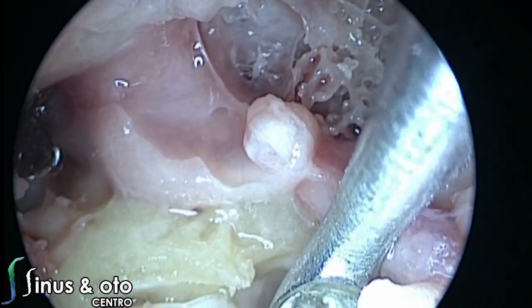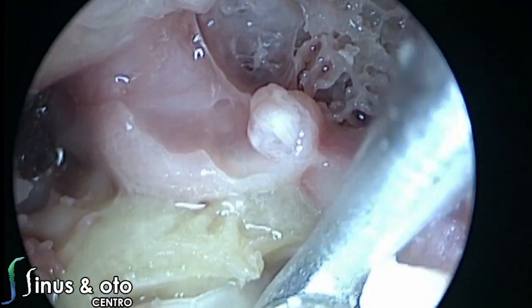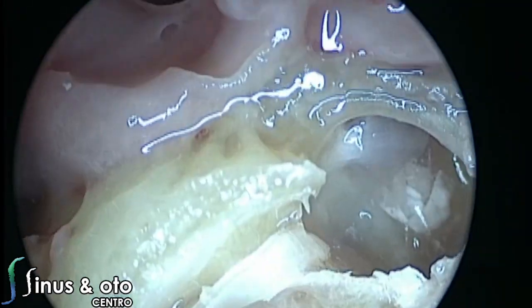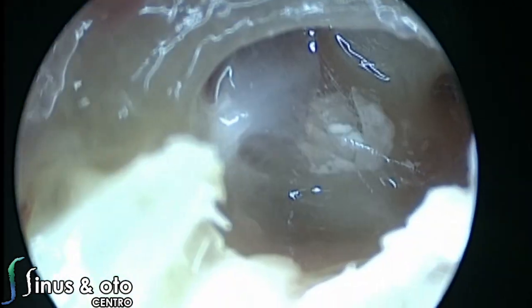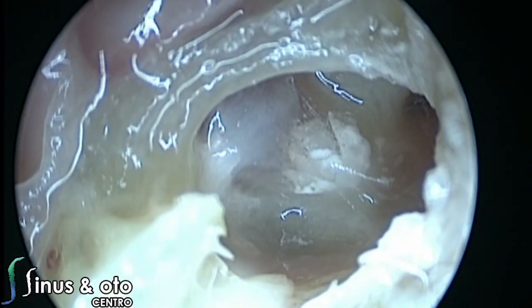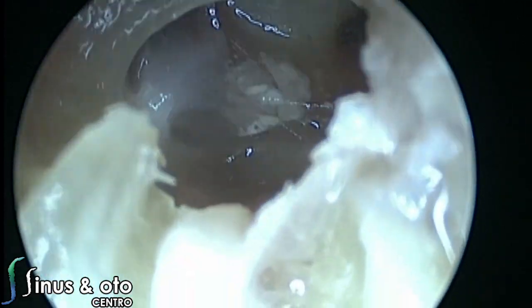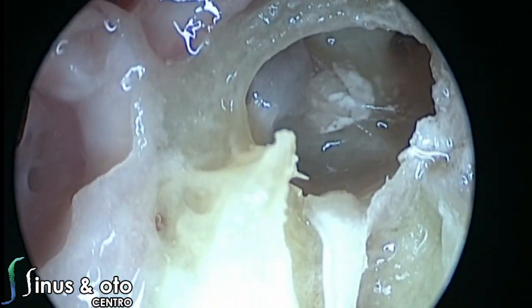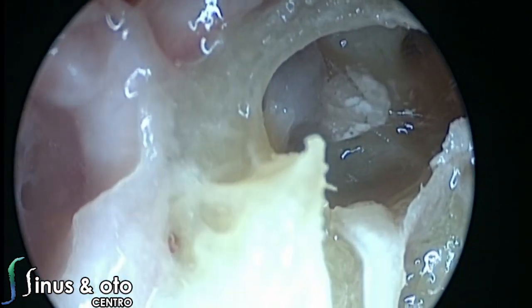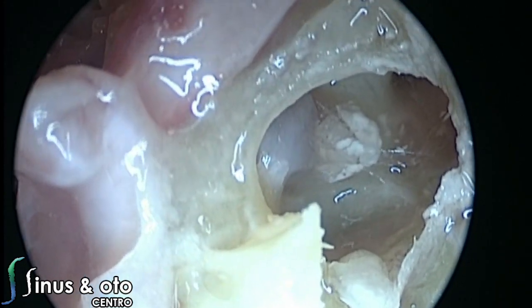We could remove a little bit of this bone that we cannot see. Then if we angulate, we are using a 4mm 30-degree endoscope, we see the hole over there, which is the entrance of the posterior semicircular canal. And these white spots that we can see inside the vestibule are the otoconia. This is very important, and this anatomy is very nice.